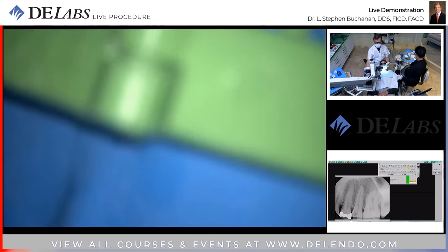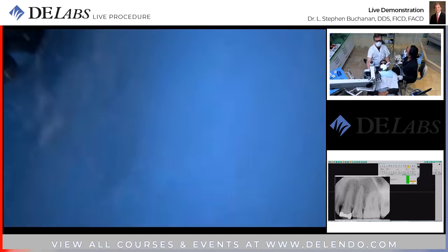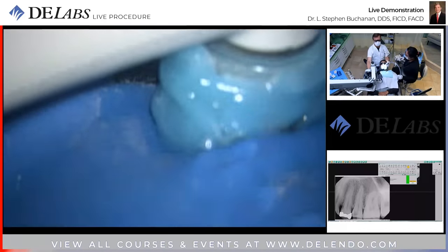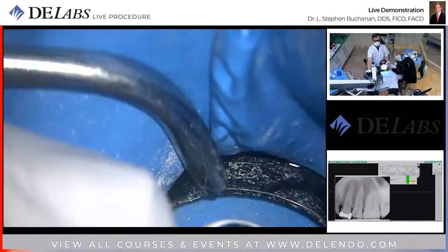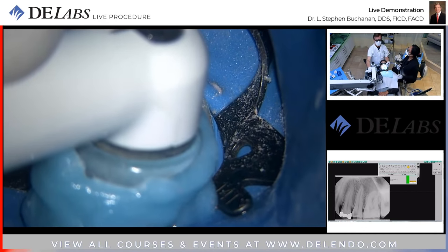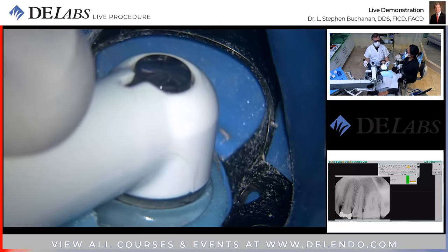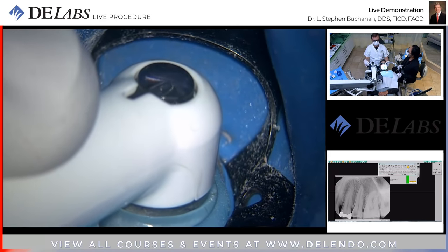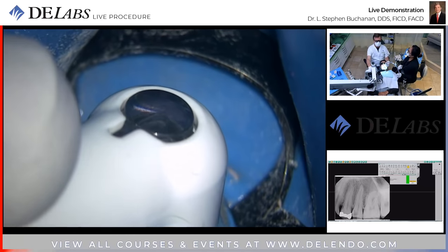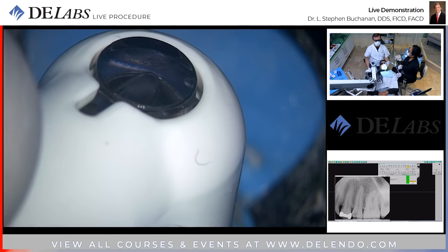Okay, so we're going to be looking at that little clear bubble on the top. Unlike the molar procedure instrument, sorry, still getting used to my scope. Okay, here we go. So what am I looking for? I'm looking for presence of a bunch of air bubbles. Now, these little intermittent things are exactly what is expected. See, they immediately dissipate.